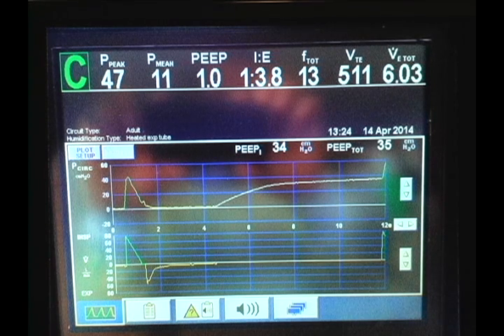Ernie knows, but imagine that you blocked off the airway and the patient is blowing out, pushing out. What's that going to do to the pressure that the ventilator measures? Keep going up like this. So I remember, I forget who the fellow was, Ernie, but I remember I said, well, I think that's active exhalation. And he said, there's no way.